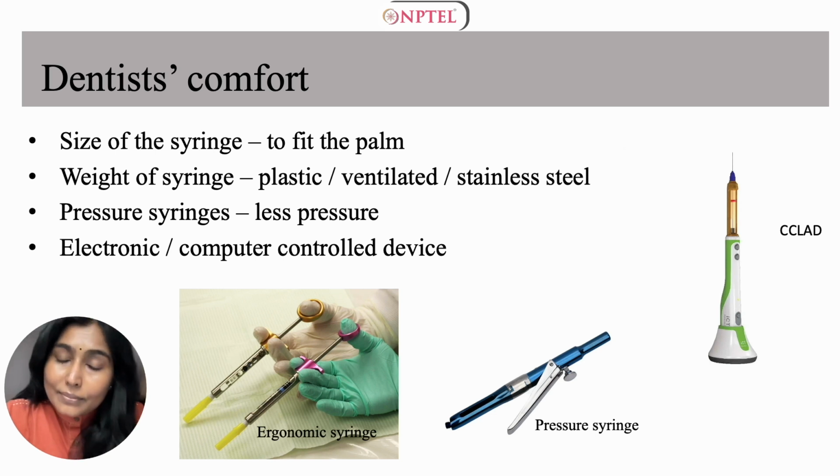Also, you could think about using computer controlled local anesthetic delivery systems. They are extremely ergonomic to use because you are going to use only the pen grasp. Also, you do not have to focus on multiple things at the same time. Foot control, if you're using a wand, to regulate the flow of injecting the local anesthetic solution. But the most important advantage is the pen grasp, which is ergonomic to a dentist.